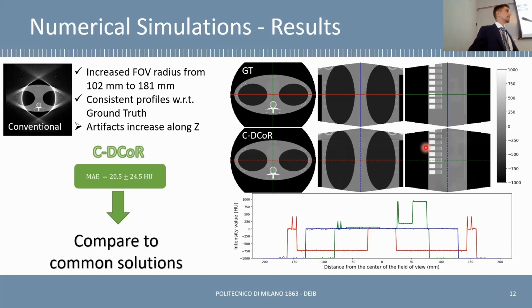So everything's based on SART. You're essentially doing a short scan in the SART job. Okay, you have to stitch together the detector. Yeah, exactly. That works, but the real question is why you use SART for short scan. Is SART theoretically correct to do it? Well, correct in the sense that it's doing the best it can with the data. You have a 360 scan.